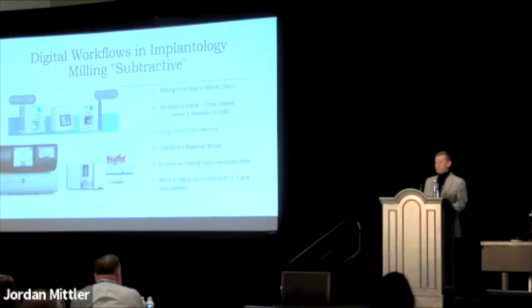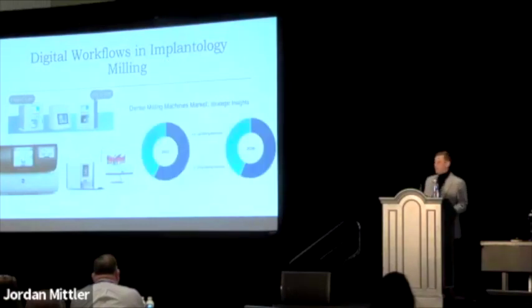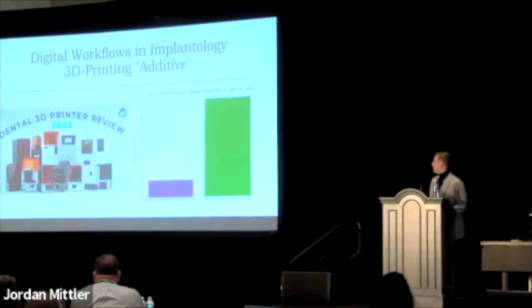Most offices, the mills are going to be limited to 1 to 3 unit restorations. I think that milling is going to obviously have a big place in dentistry for many years to come. But what this graph is showing is that there's not much growth predicted in milling industry, lab, or dental office over the coming years.